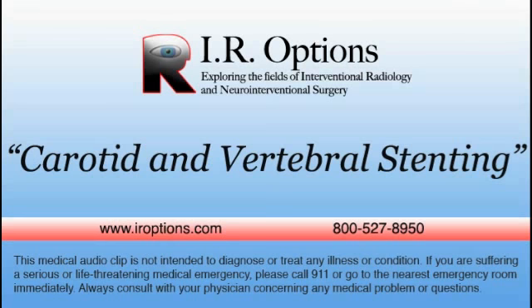A stent is a thin metal mesh tube designed to hold open a vascular segment narrowed by atherosclerosis, and thus facilitate normal blood flow. The stent insertion is accomplished by an IR physician through a small groin puncture under local anesthesia. After the plaque causing the narrowing is balloon dilated, a process known as angioplasty, a stent is deployed at the site of the dilated stenosis.